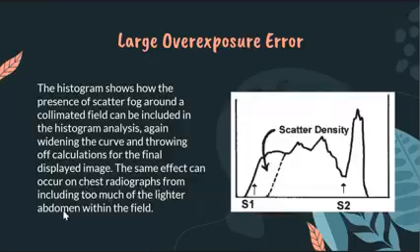Ayan, lighter abdomen. So that means when we say lighter, production of may include siya sa histogram on the part of the S1 because again, from white to black man siya. Okay? So when there is scatter density here, it throws off the calculation of the histogram na dapat dito lang man yan siya, but because of scatter density, na-widen ang range ng inyong histogram. Therefore, pag ma-include yung scatter density in the histogram, it will result to underexposure of the image. Although there is no underexposure din na nangyari, but because of the scatter density, no, parang underexposed ang inyong image.